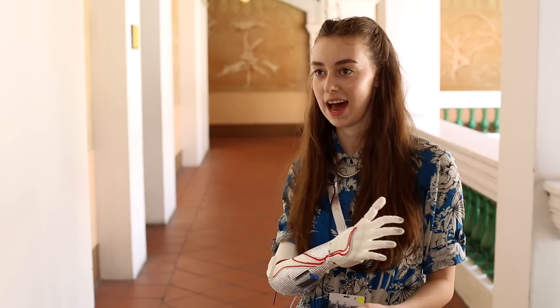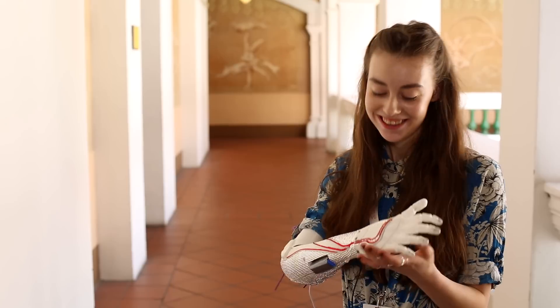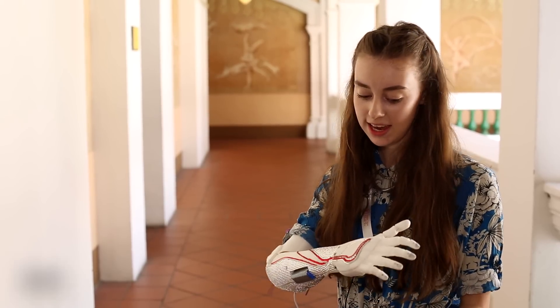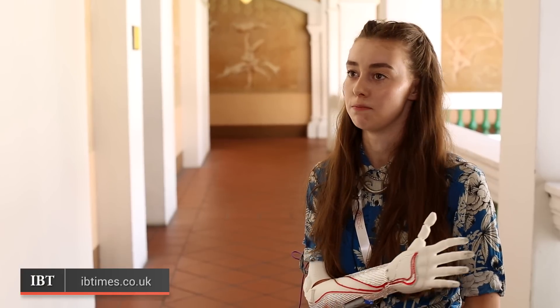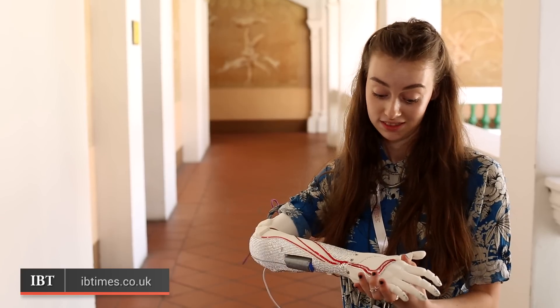In years to come, I would like to have a different arm for every outfit — like shoes. That would be fab. It can always be lighter and it can always be improved, but so can everything else. So I'm really excited. It's really exciting.